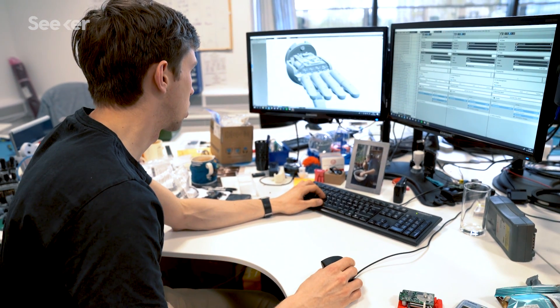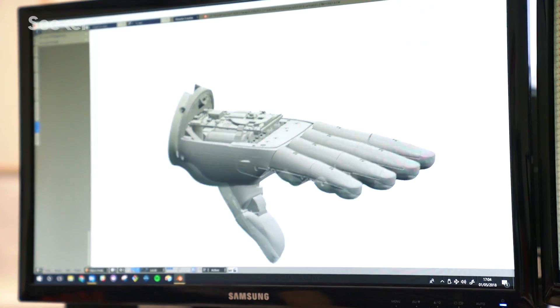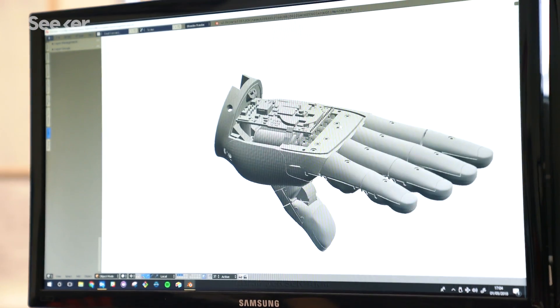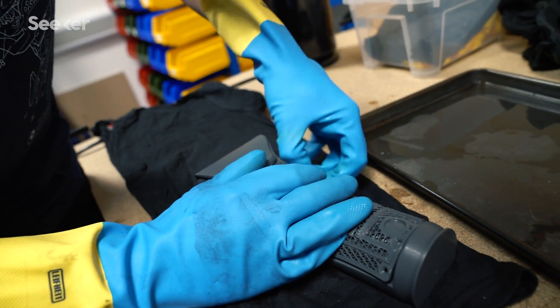The first thing that happens is a prosthetist gets a model of the user's arm — physical or digital from a 3D scan. We feed that into our software algorithms to create a bespoke Hero Arm for that individual, then export the files for the 3D printers, print them, and assemble everything together into that person's Hero Arm.